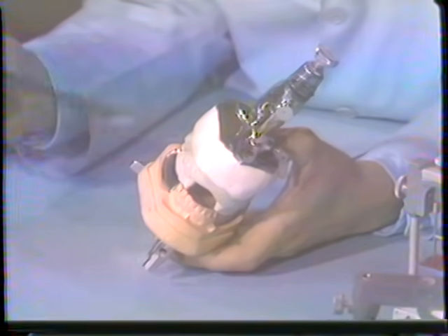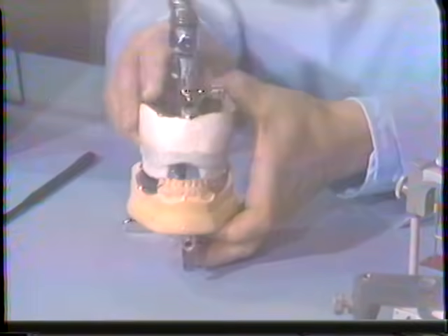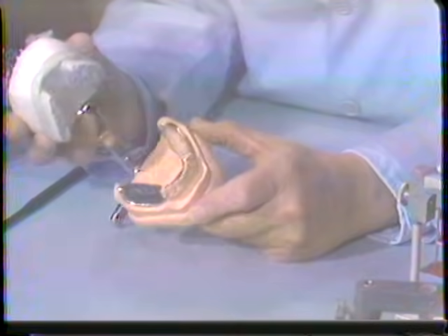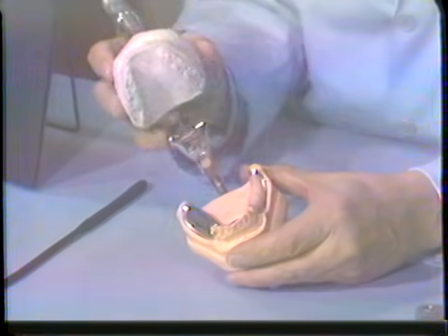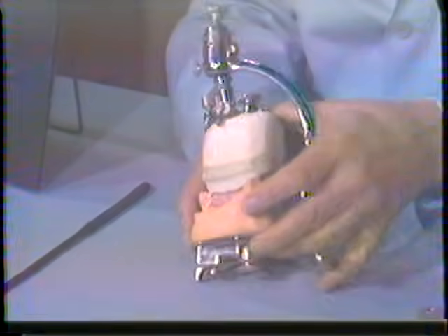There's a step-by-step procedure through which this can be done. And then the occlusal paths are traced out on wax, and a template made, as shown here for the removable partial, and the teeth are set to the template, as we have done on the opposite side already.